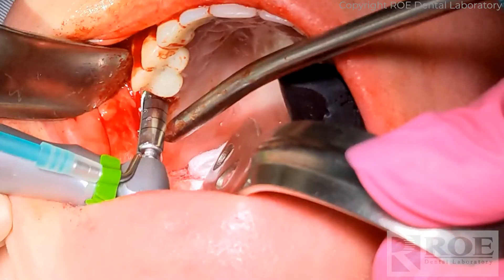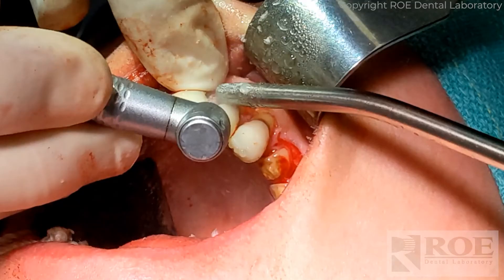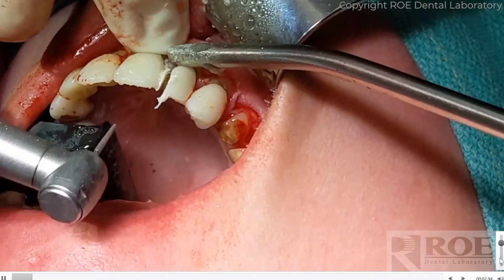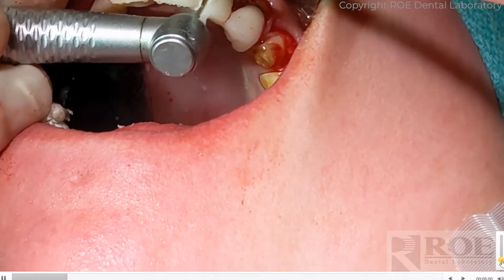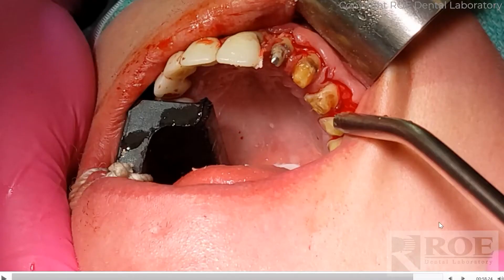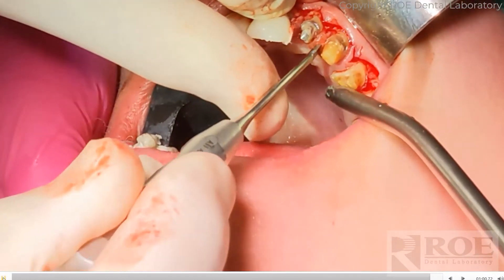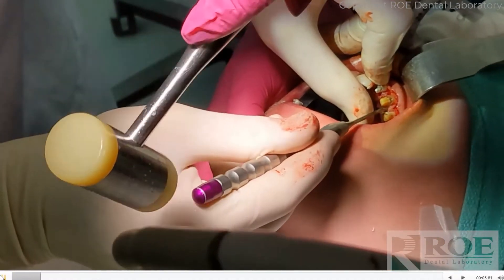Implant removed. Next is to section the bridge. Unfortunately the patient is in the temporary, so the temporary served as teeth during the CT scan and registering models and so forth, as opposed to natural teeth, and it really worked well. Now we're going to remove the teeth on the list.